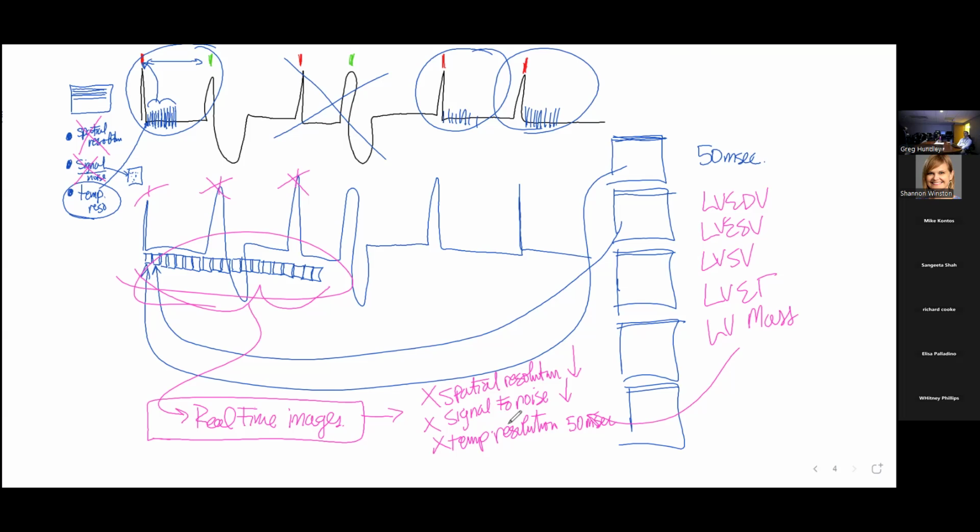Now, 2 weeks from now, we've got to measure blood flow, and we'll talk a little bit about perfusion. And then you'll have your total toolkit, and that's what you pretty much need for being a technologist in this space, and also to be an image interpreter. If you know these 3 buckets of things, you're going to be able to get through 95% of what you need to do to answer the case.